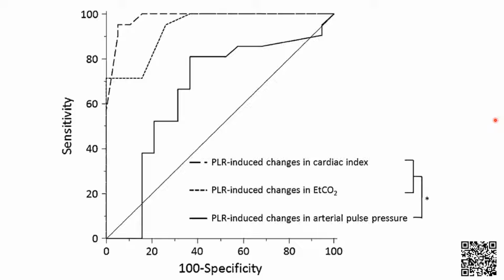And this is something you can think of when you have a patient who doesn't meet criteria for other, perhaps more robust measures of preload responsiveness, or if somebody doesn't have an arterial line to measure pulse pressure variation or to use one of our non-invasive cardiac monitors. This would be something that you could consider if the patient is passive with stable ventilation.